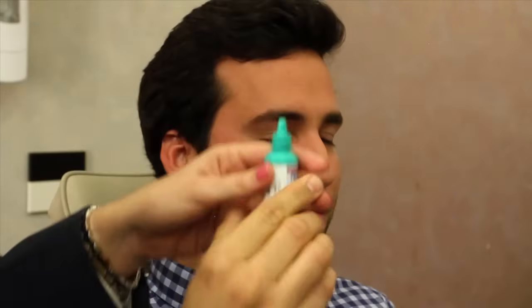Great job. Notice how he made sure to keep the bottle a safe distance from his eye so as not to contaminate it.